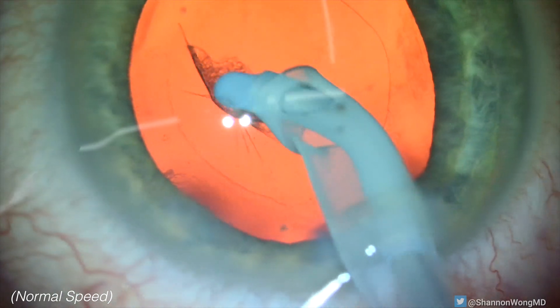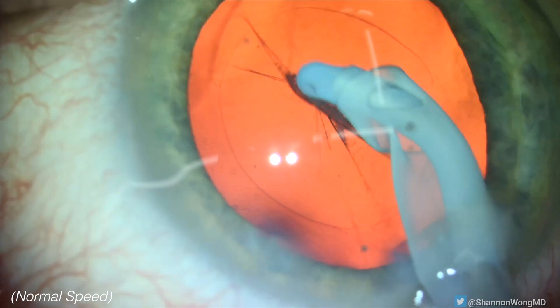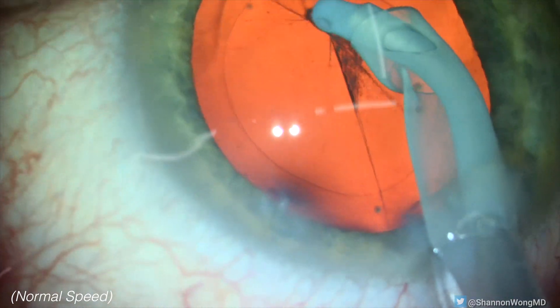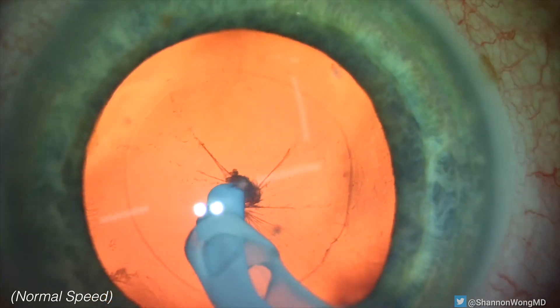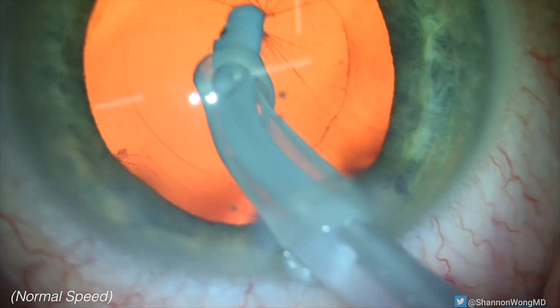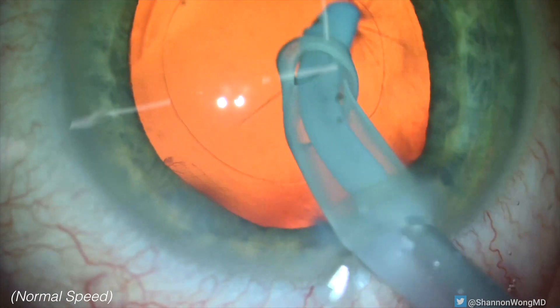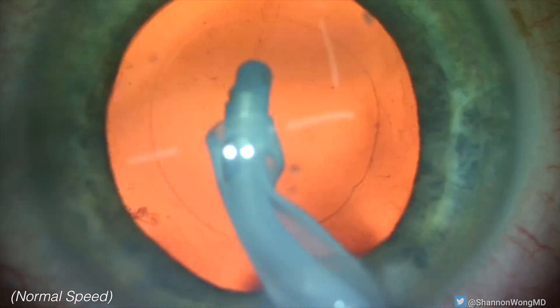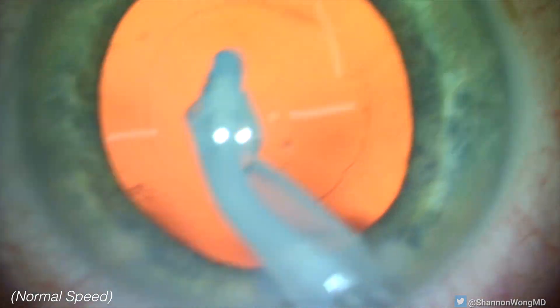Once the equatorial cortex is removed, we direct our attention to the posterior subcapsular cataract plaque that is adherent to the posterior lens capsule. We could polish the plaque with the posterior surface of the silicone tip IA, or we could gently directly aspirate the plaque with the aspiration port of the IA. We choose to directly aspirate it and do it with ease.